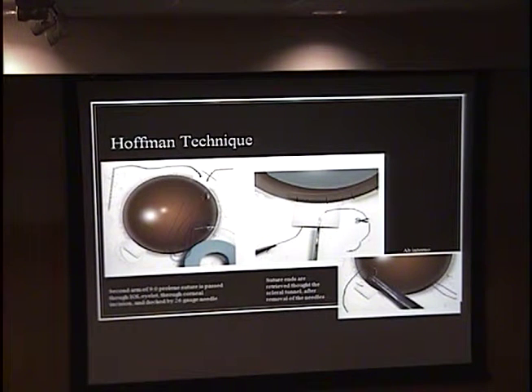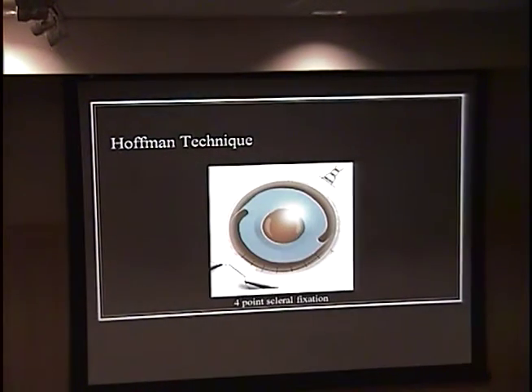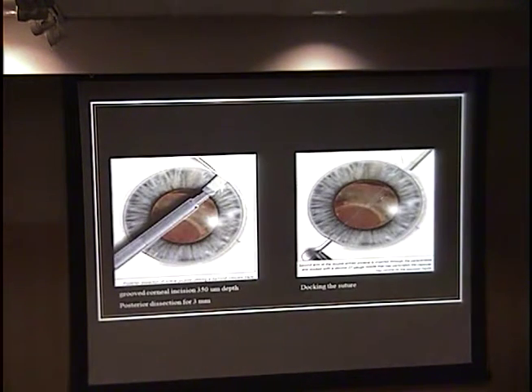So after you've done that twice, you have the two sutures coming out of the roof of the scleral pocket, and this is just showing how to retrieve the suture ends from underneath there, and then you would tie them down. So you'd end up with 4-point scleral fixation, two over here and then two over there, so it's pretty secure.